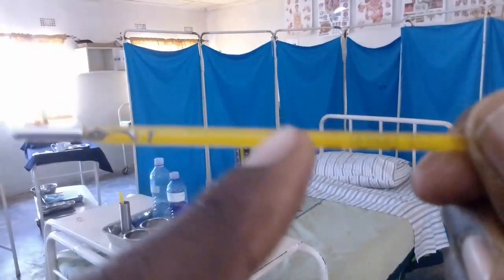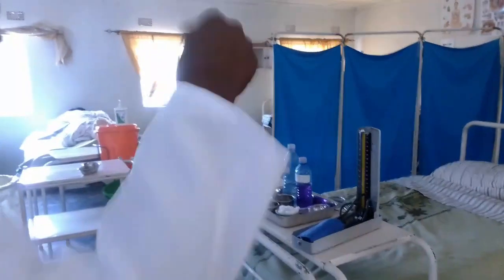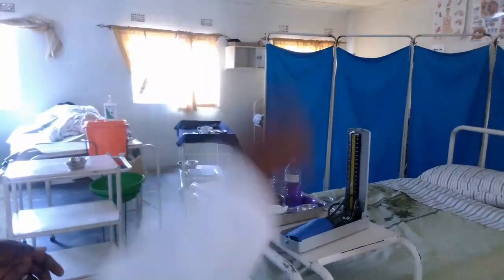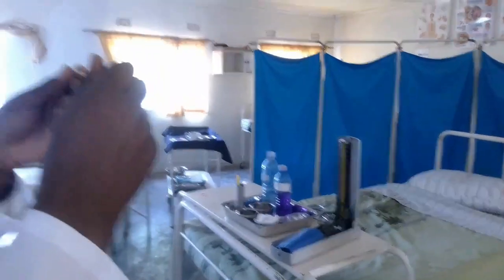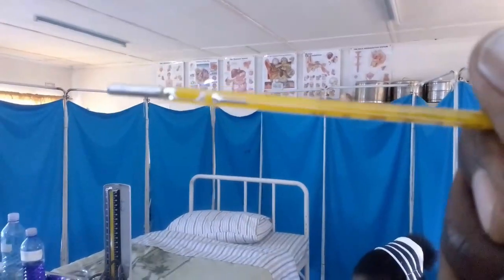So you can't use it like this. You have to shake it. You have to shake. Then see again. Okay. So as you can see, mercury has gone back into that line there. So mercury has gone back. Now you can use it.